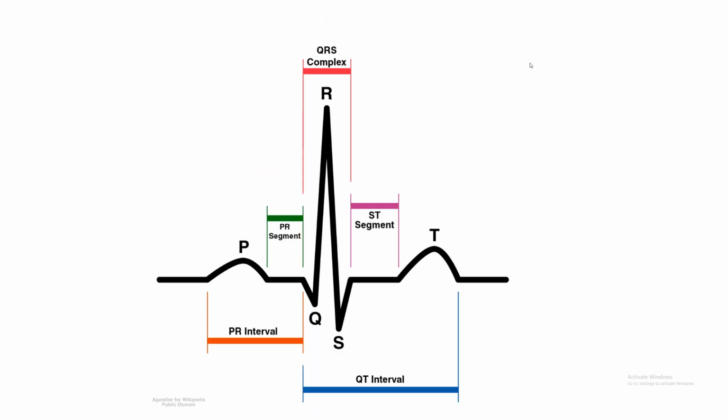All right, so we talked about the conduction system. We talked about the action potential. Now let's just put it all together so we understand what's going on in the QRS before we start talking about dysrhythmias, which we will talk about very shortly. So again, what does the P wave mean? Atrial depolarization, left and right atria, atrial contraction, right? PR segment, little pause, AV node holding onto that electrical impulse. QRS, ventricular depolarization, leading to ventricular contraction, right?